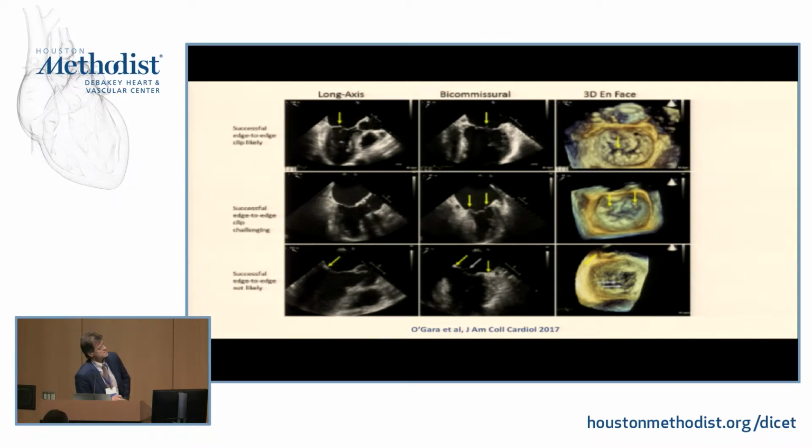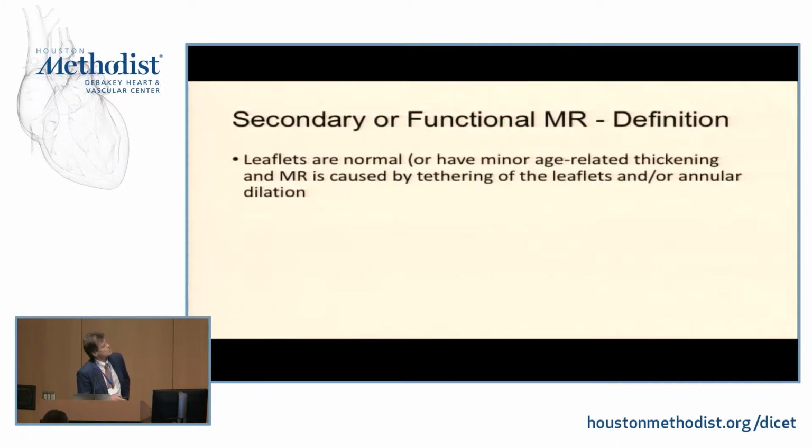When there's severe MAC and the leaflets are stiff and thickened, you'll create mitral stenosis with the clip. You might get rid of the MR, but you'll get rid of the patient too. And so you want to avoid that.